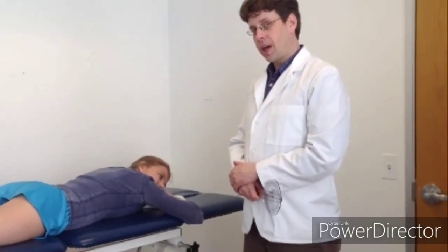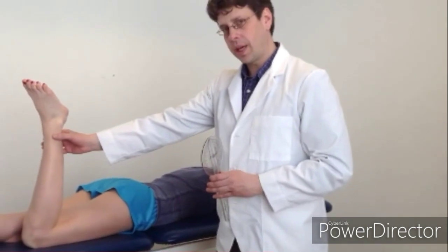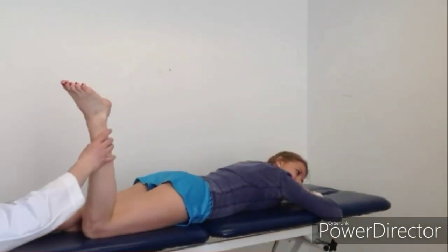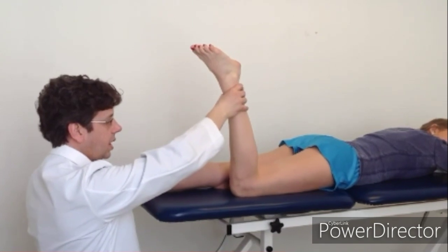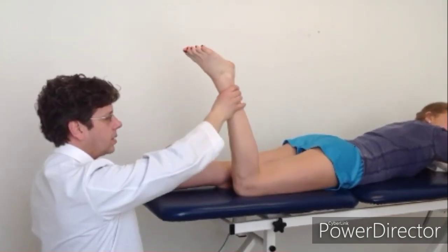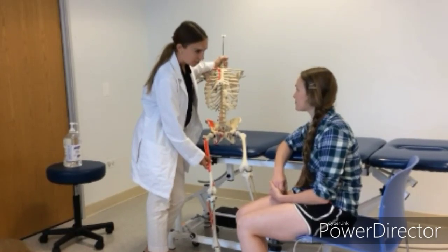Another position that you might want to put the patient in to measure hip internal rotation is in prone, as Kelsey's demonstrating. You would have the patient bring their leg up to a 90-degree angle like this. You're taking the measurement from here, and then show your patient the direction that you want to move them. You can do this as long as there's not tightness at the rectus femoris. And you would use the same goni landmarks that you did today. So we're going to differentiate those.